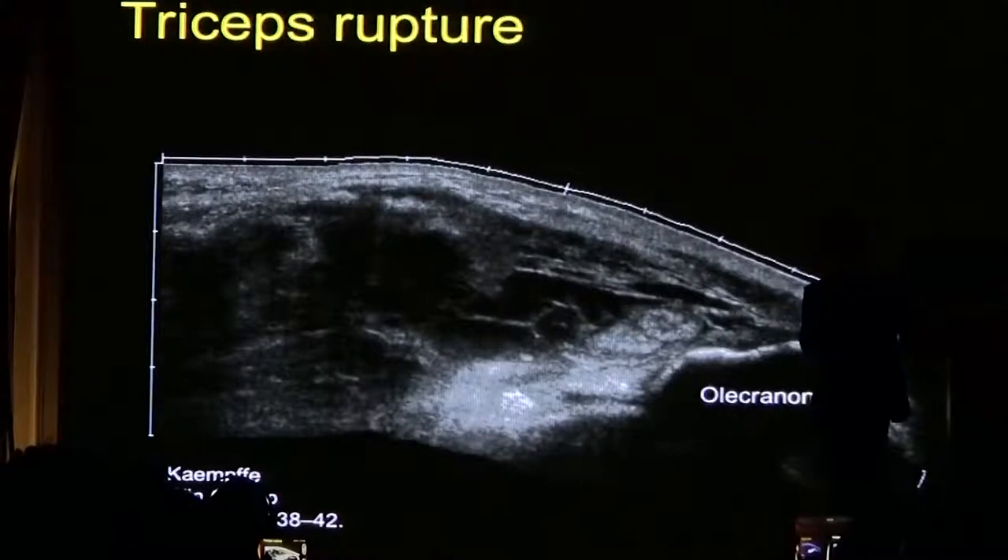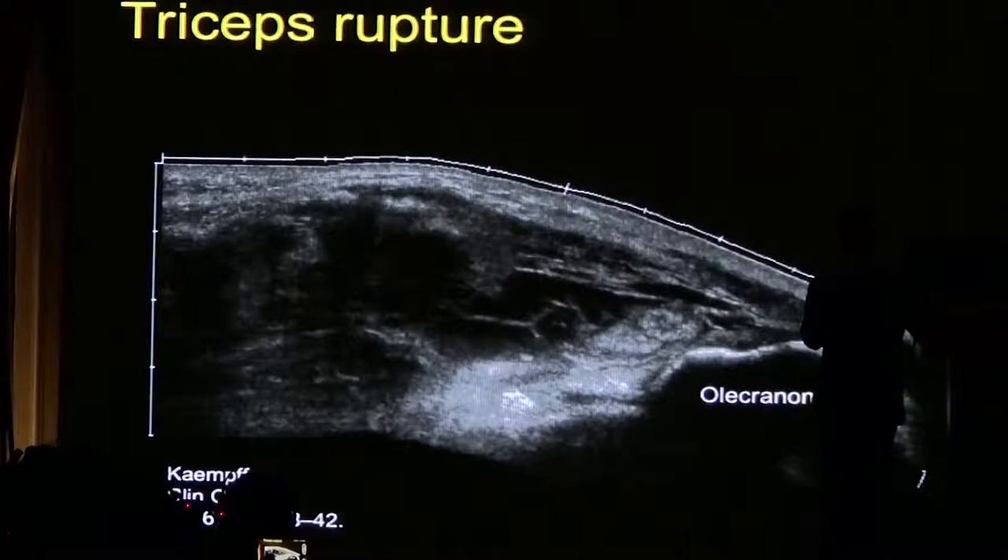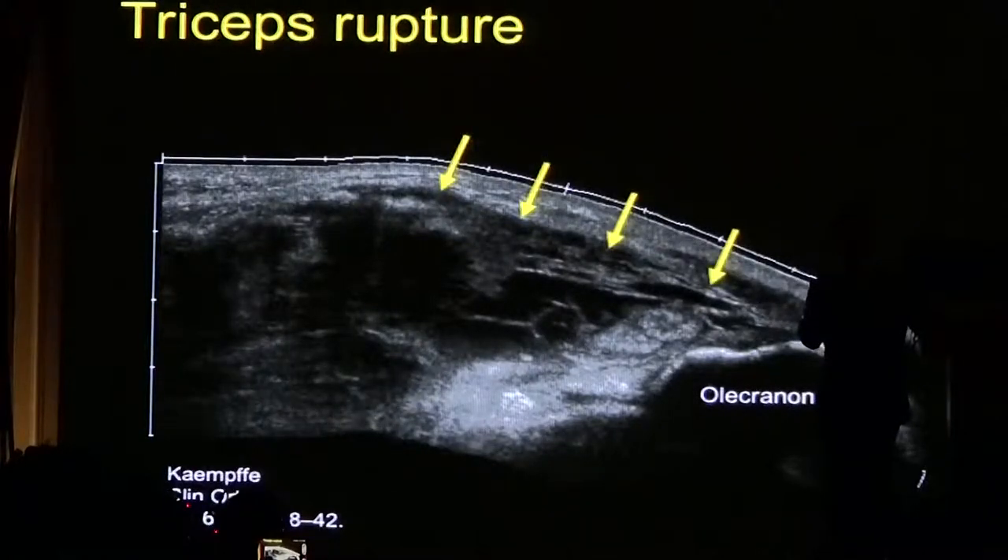Sometimes in elderly patients or in patients who are using steroids, you might see a rupture of the triceps tendon. Usually clinically this is quite obvious with a gap felt. Here you can see retraction of the tendon away from the insertion on the olecranon.